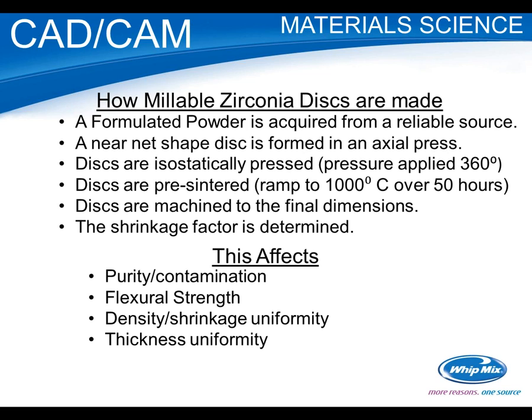And again, not to be critical, but there are a lot of manufacturers now on zirconia discs, and a lot of these players come out of, because I was talking to Tosel, and they wouldn't give me names, but who are the key players in dental? Are they dental companies? And he said, yeah, some are dental, but a lot of them are the industrial ceramic companies that have the equipment and they see the need, so now they're also making zirconia discs for dental. So hopefully they've got a clean room or a cleaner room, and they're not doing that out there in their general production areas.